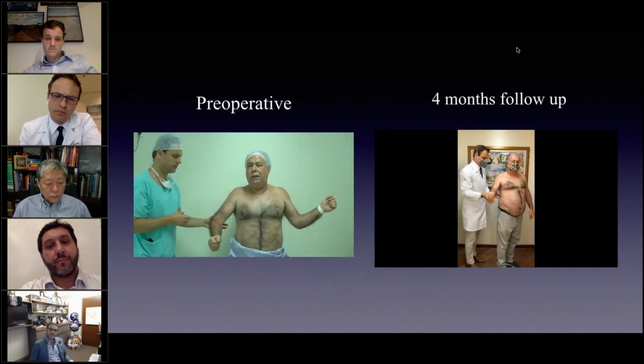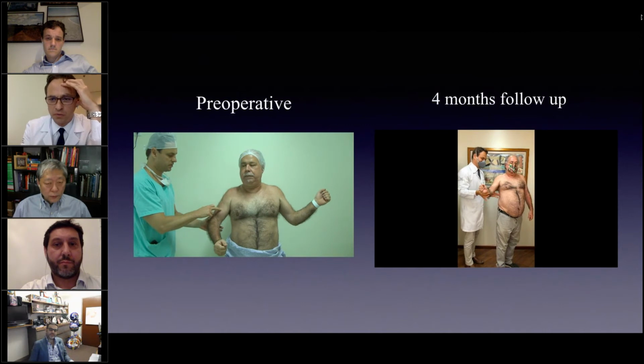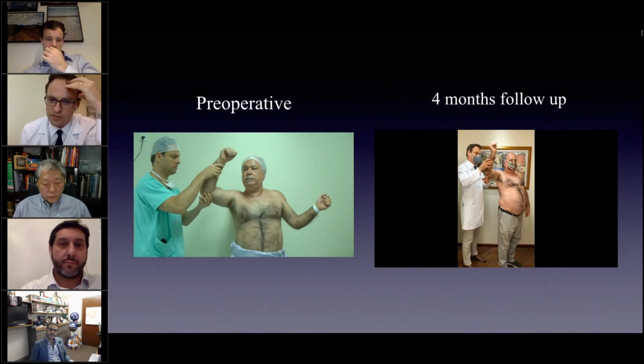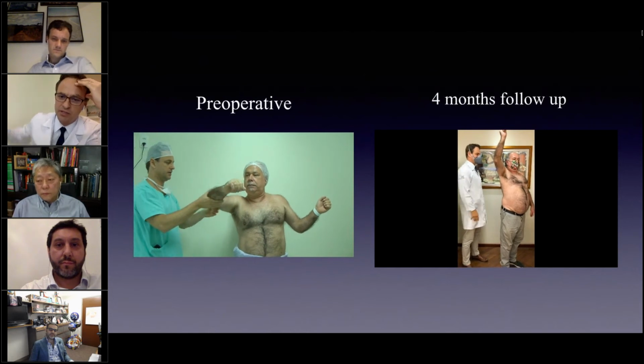Then we can see preoperative lag sign and postoperative, he's restoring external active elevation, but check what is interesting, he can raise his arm and keep in abduction and external rotation.